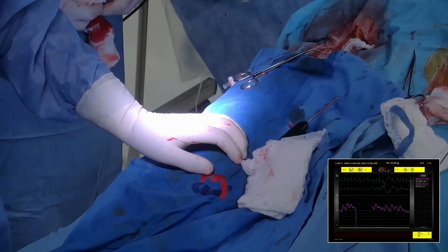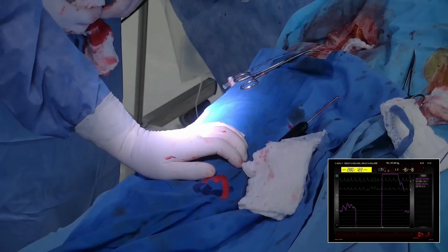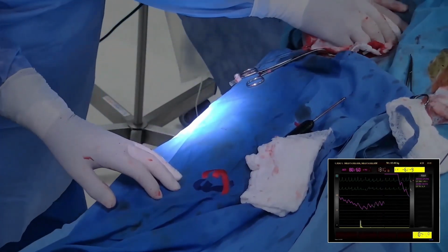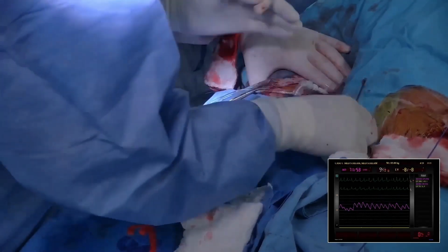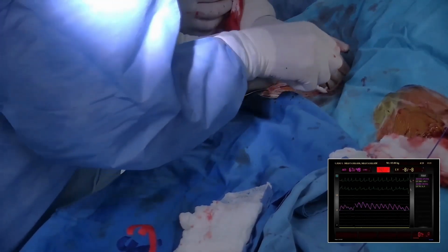And I think we have more than acceptable closing. We can compress with that balloon for probably 4 or 5 minutes. I will cut the thread so that I don't strain the suture anymore.